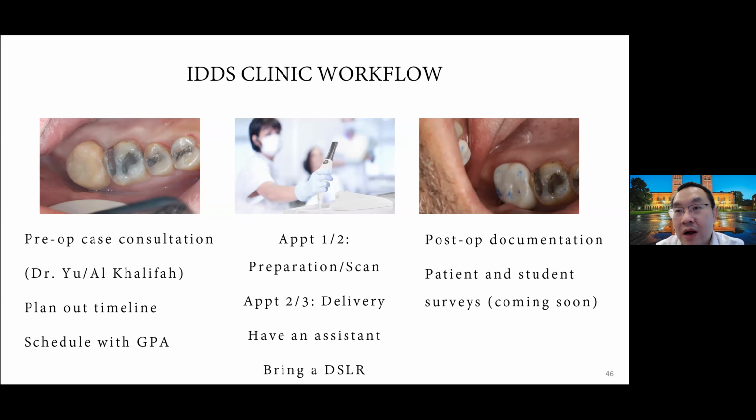A lot of times when you need to grab something extra, it's best to send your assistant over instead of running around yourself. And bring a DSLR camera, because we need to take pictures along the way.